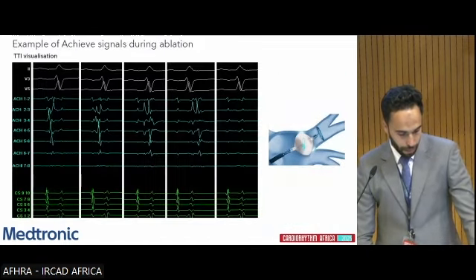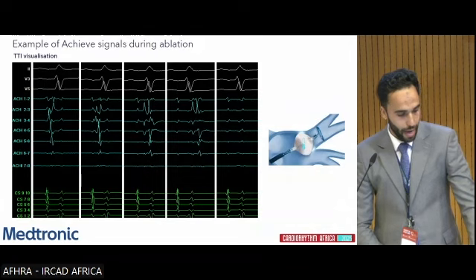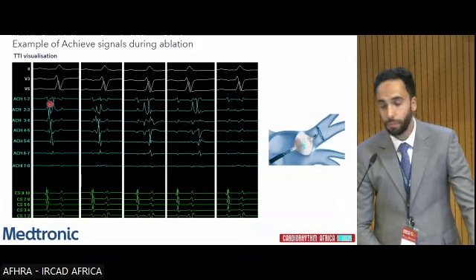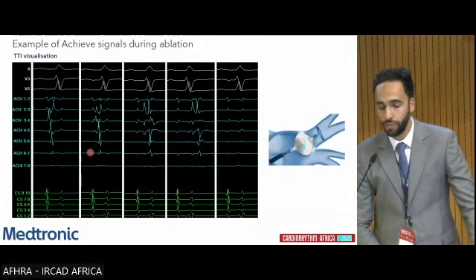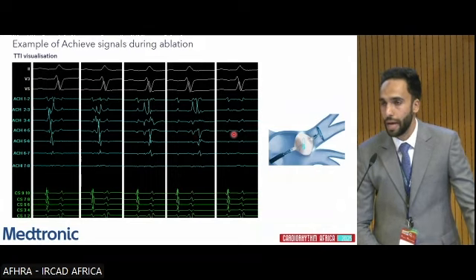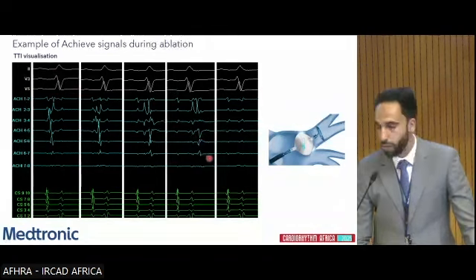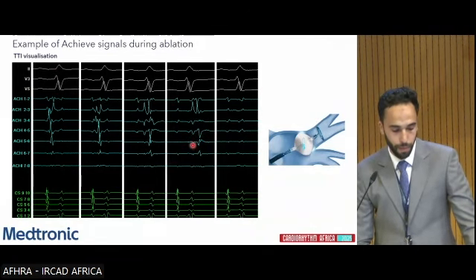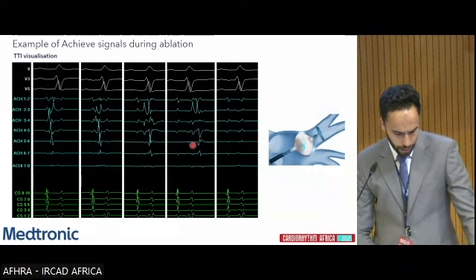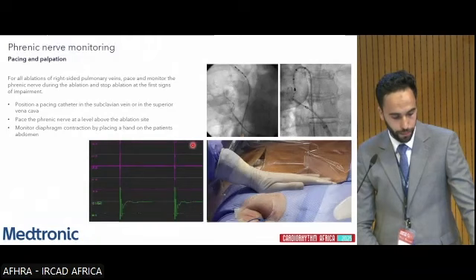In this picture, we start freezing. At this phase, we have a potential in the pulmonary vein, and after we start freezing, the potential is gone at the end of 4 minutes. The most common time to isolate the vein became 60 seconds.